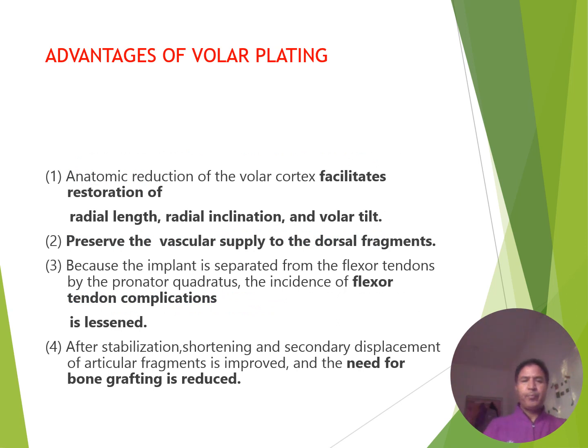Advantages of volar plating. Anatomical reduction of the volar cortex facilitates restoration of radial length, radial inclination and volar tilt, and preserves the vascular supply to the dorsal fragment. Because the implant is separated from the flexor tendons by the pronator quadratus, the incidence of flexor tendon complications is lessened. After stabilization, shortening and secondary displacement of articular fragments is improved and the need for bone grafting is reduced.